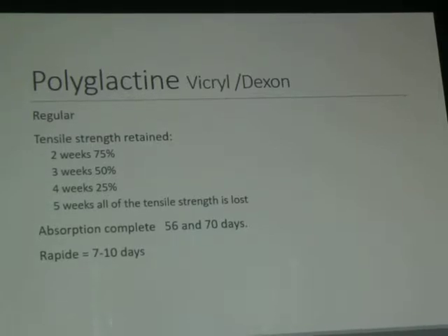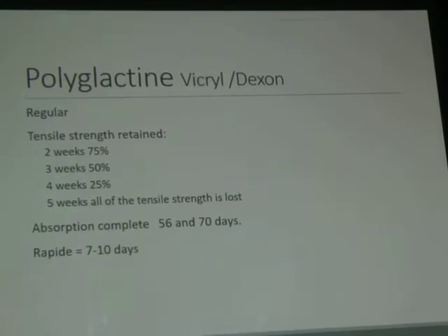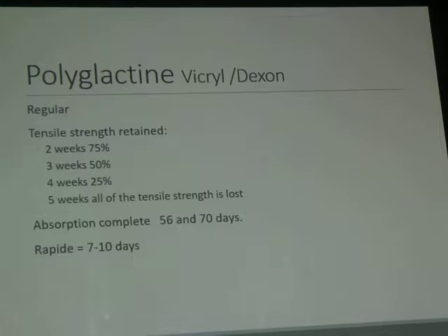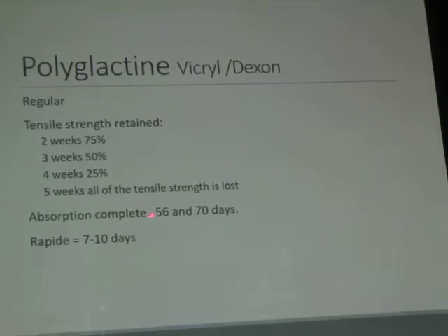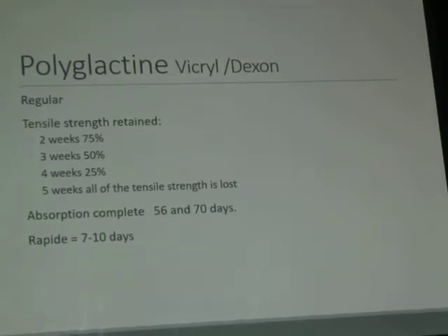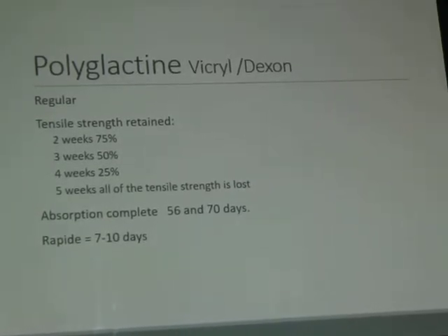فبعد أسبوعين خلاص يعني ابتدى الstrength بتاعه يقل. فعشان كده we cannot use polyglactin if we know that the tissue will take longer than 2 weeks to heal. By 5 weeks it does not exist, even if you physically see it. انت شايف الغرزة، وكتير قوي بنشوف الكلام ده، نلاقي الغرزة الفيكريل ما زالت موجودة. But after 5 weeks if you just pull it up it will dissolve in your hands.